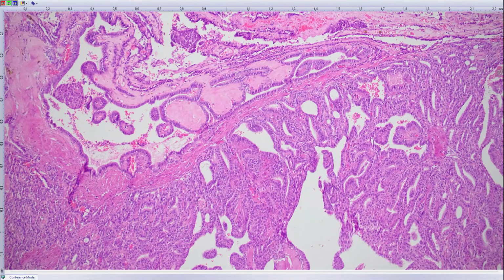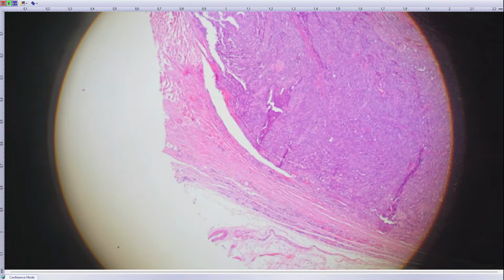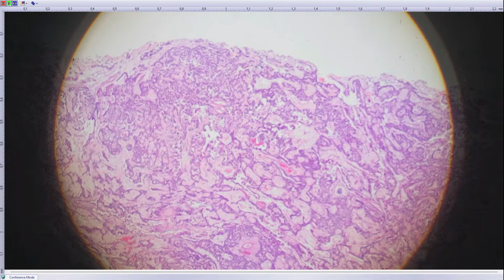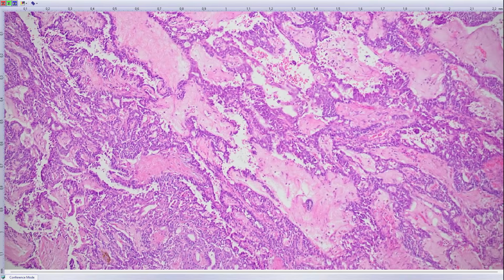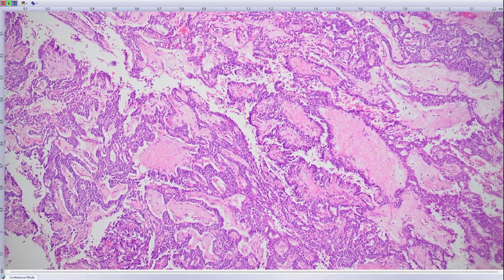Yeah, it is a tumor of the thyroid. It's a quite rare type of tumor of the thyroid. When you see cytologically the papillae that are confluent, these confluent papillae are very different from papillary carcinoma.